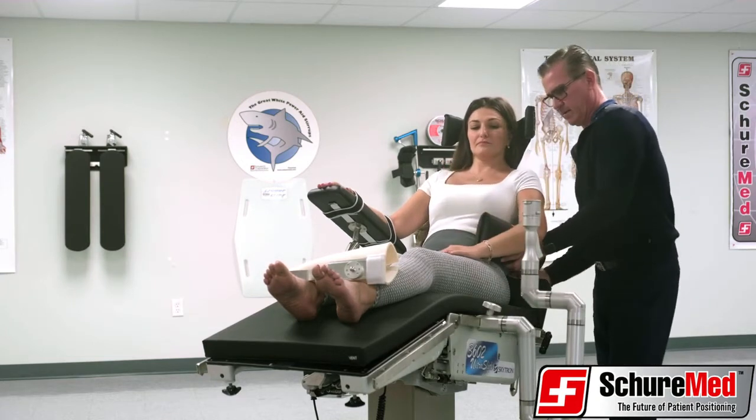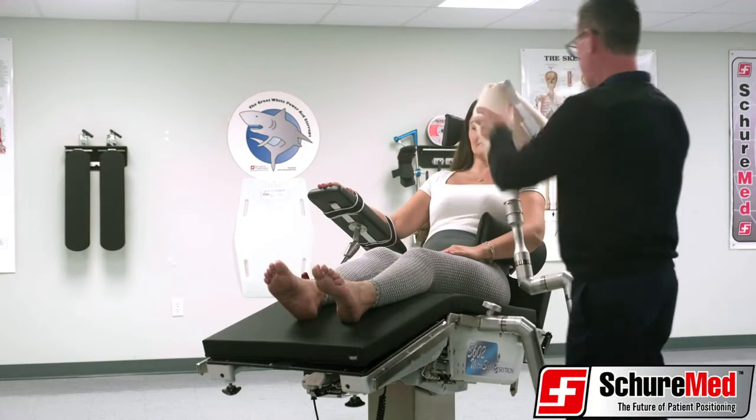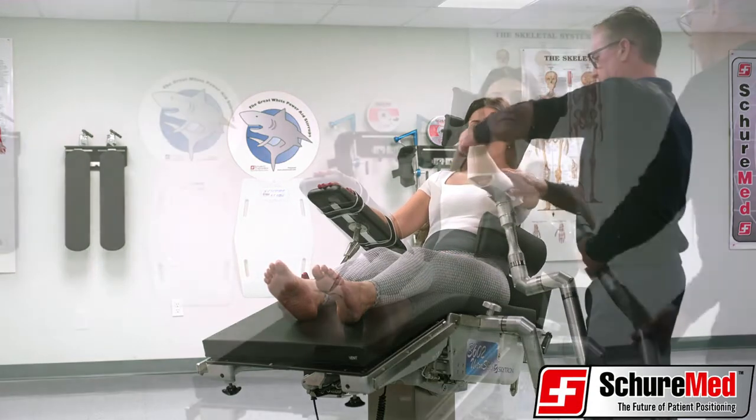SureMed's disposable SureLock XPS sterile kit includes a sterile drape, forearm wrap, and Coban. After connecting the forearm attachment, line the attachment with the sterile liner and wrap the forearm with Coban.